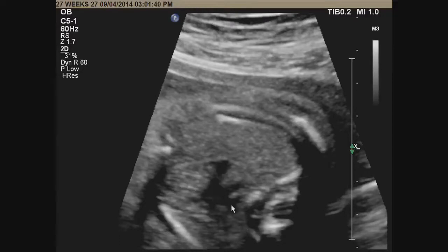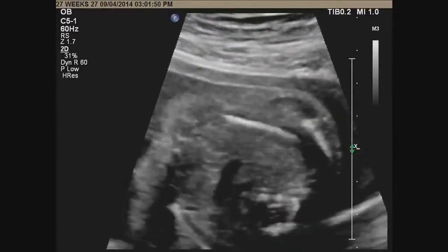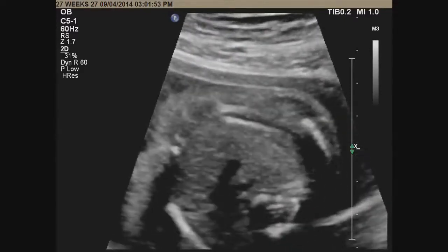Okay? So that is a plane that is normal. You're very high up in the chest. And be careful that this is called the transverse arch view. And then if you slide slightly above that, you'll see what we call the brachiocephalic vein.